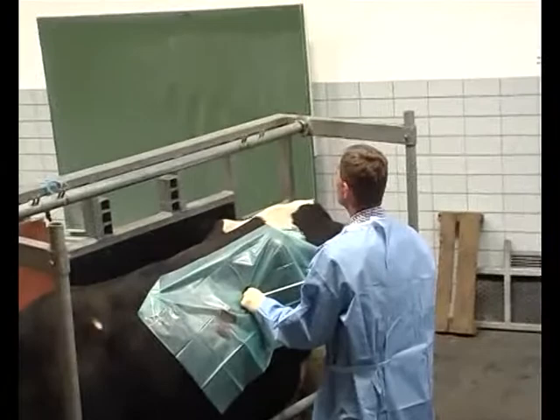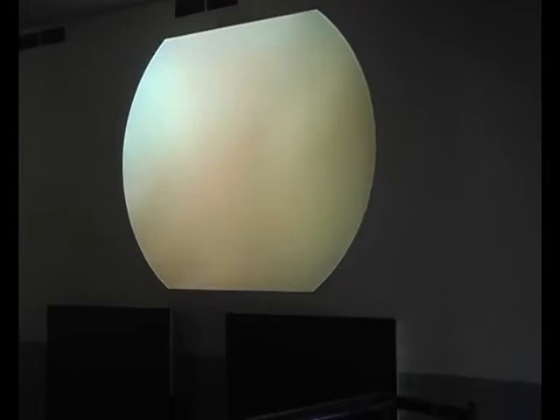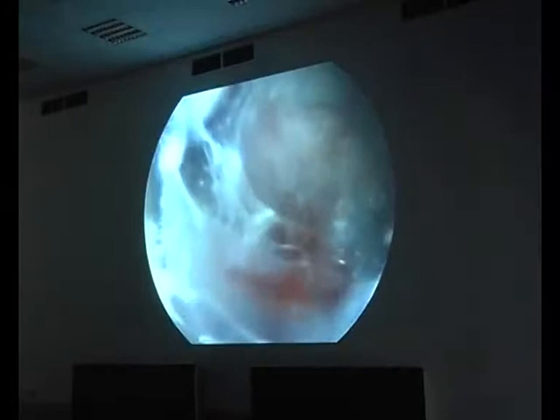You can see this is fat, so this is not what we want. And normally if your screen is not optimal, you tip against the rumen. This is between the muscles and the fat, so the position is not all right. I didn't pump in air, but if you should bring in air, then there's a problem. So we go out again.